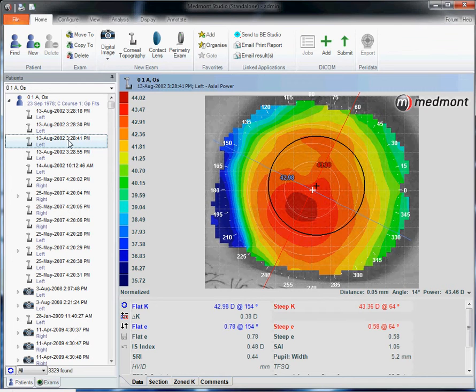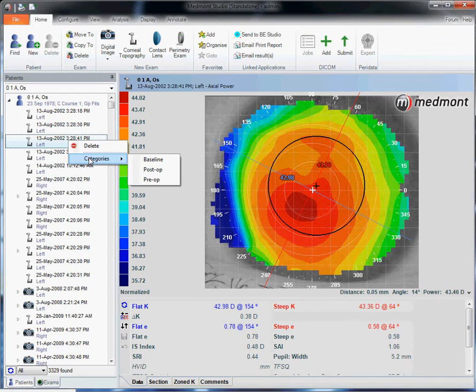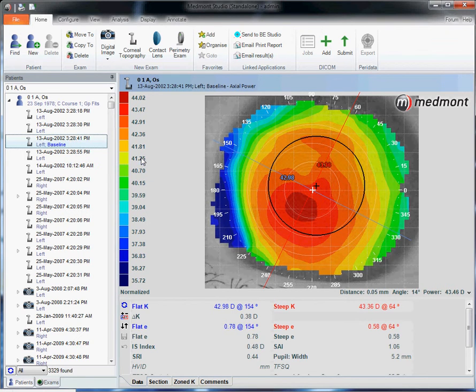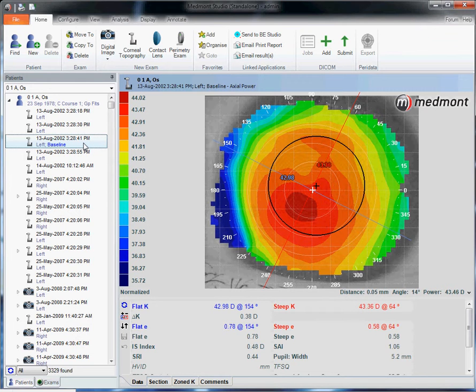Once you've highlighted that topography, right-click and select from the categories baseline. That way you see this little label affixed whenever this patient visits again. One week from now, one month from now, one year from now, we know that we're going to use this as our best baseline topography.